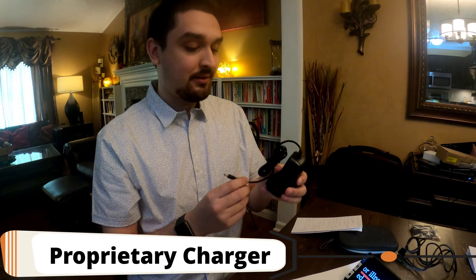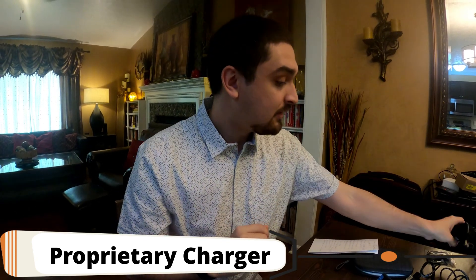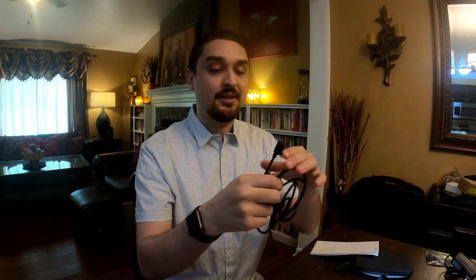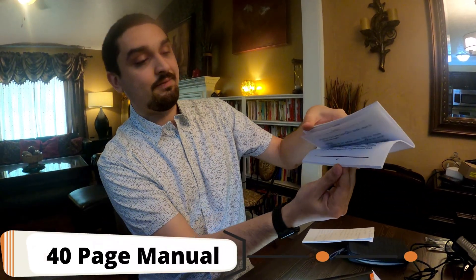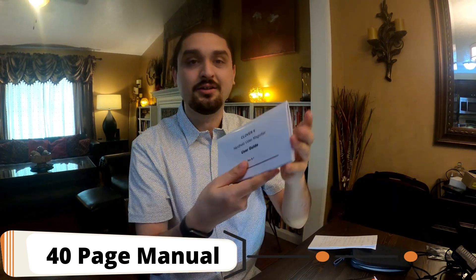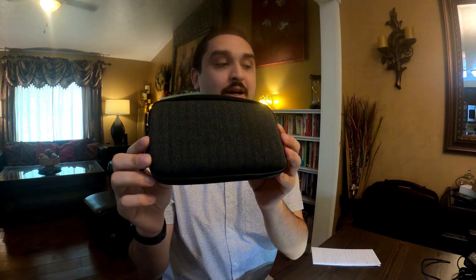A few notes: like with most video magnifiers, this charging cable is proprietary so do not lose it. This one has the option for an HDMI connector so you can connect it to a monitor or television and blow your image up a whole lot more if this screen is too small. It has a very detailed 45-page manual in large print, and it comes with a cleaning cloth, a lanyard, and a cloth carrying case.